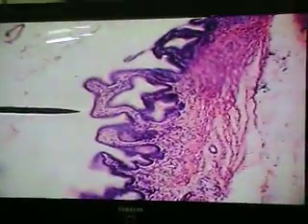What about the epithelium? When we visualize the epithelium of the gallbladder, it's going to depend a lot on what happened to the animal when it died. If this animal was fixed immediately after death, then the picture is going to be good, and in this slide you can see the picture is relatively good. But if you don't wash out the bile quickly, then the bile will start to degrade.